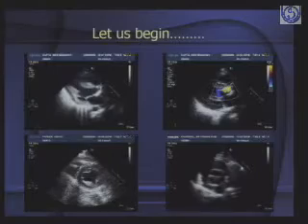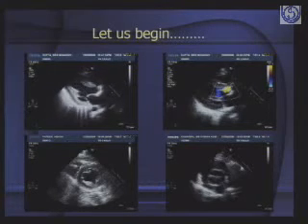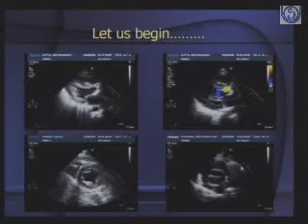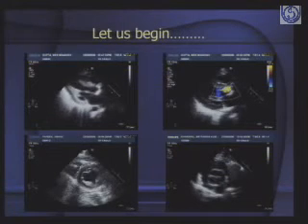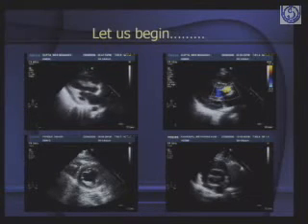Again, aortic regurgitation is another condition in which there is a long asymptomatic period. A person can have aortic regurgitation, you can hear the murmur, the diastolic pressures are low, and yet the patient says, look, I'm fine. Echocardiography helps you in their assessment.